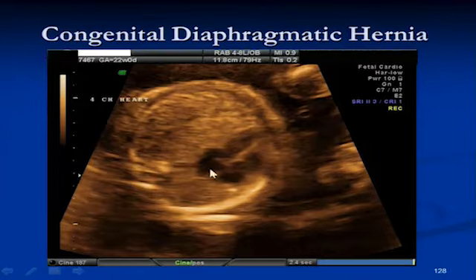In this view, okay, so here we see the heart. Does the heart axis look normal? It should really be here in the middle. This should be pushed to one side, correct? And this is really the right side of the heart, because here is the spine, so this is the left side of the heart, this is the right side, but it looks like the whole heart moved to the right a little bit.